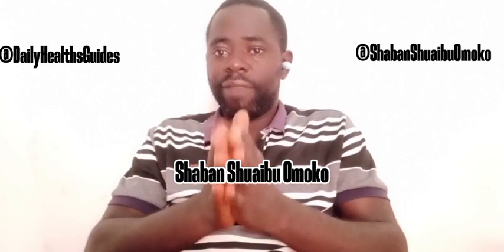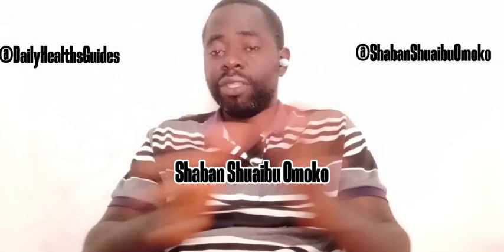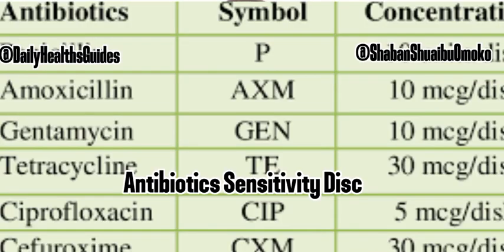After the first 24 hours, they will insert sensitivity, that is to check which of these drugs will work for it. That's one of the best aspects of MCS. The sensitivity comprises many drugs, a lot of antibiotics, and shows which drugs work for it.